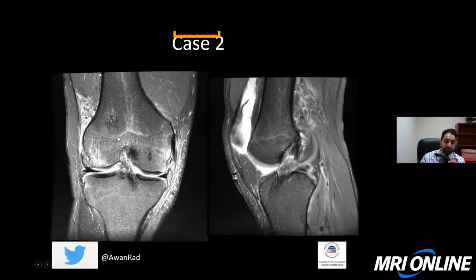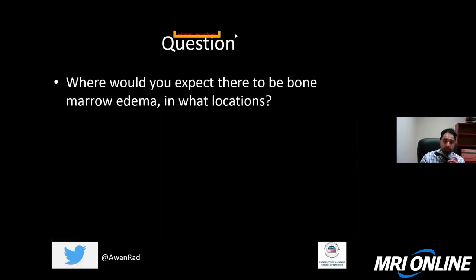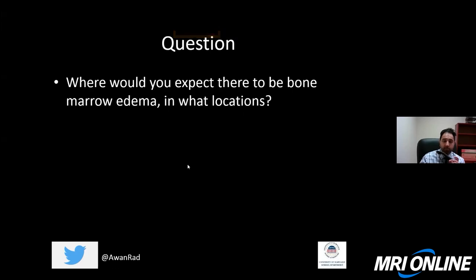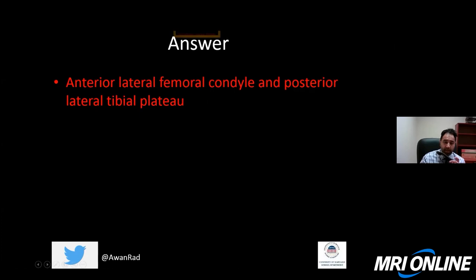Case two: this patient has status post ACL repair, with complete rupture of the graft visible. Where would you expect the bone marrow edema to be? The answer is the anterior lateral femoral condyle and posterior lateral tibial plateau — the pivot shift mechanism. This is exactly the same pattern seen even in native knees with ACL tears, resulting from the pivot shift mechanism of injury.